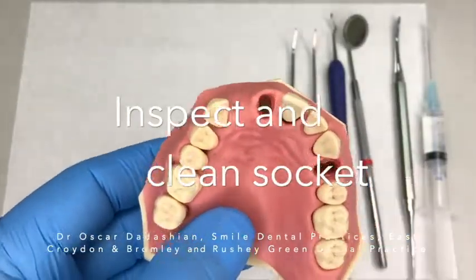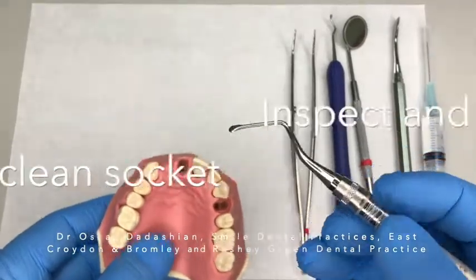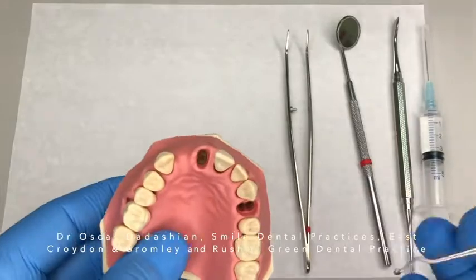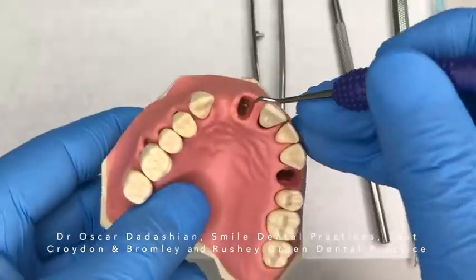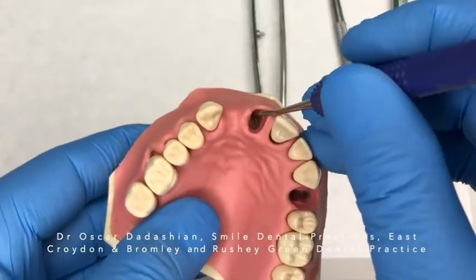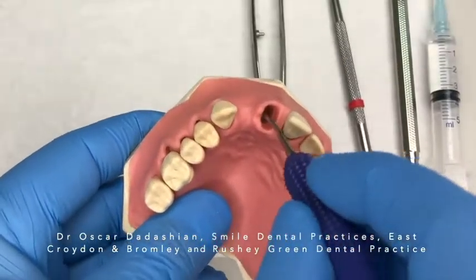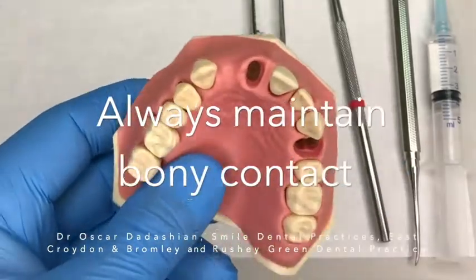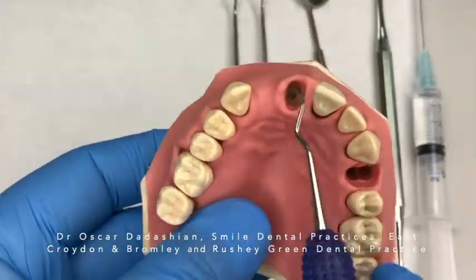First, start by inspecting your socket and use a Lucas Curette to clean the granulation tissue. If you don't have a Lucas Curette, use a long shaft excavator. Place your curette or excavator to the bottom of the socket and gently scrape the walls of the socket by coming up, always maintaining bony contact. Remove old granulation tissue and encourage bleeding.